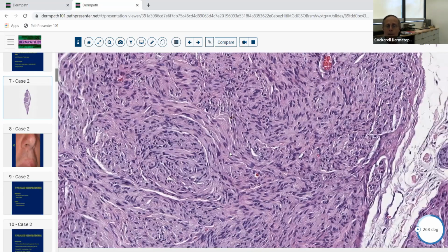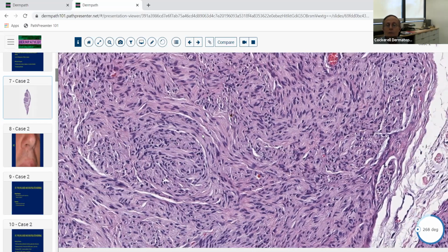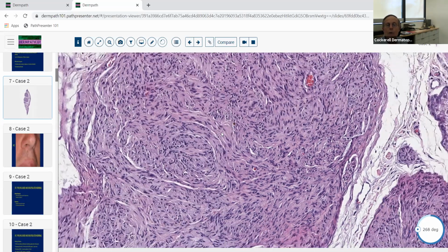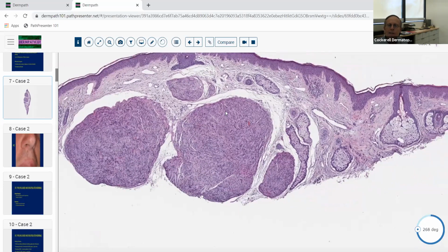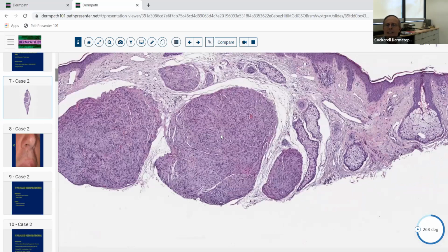And we're trying to distinguish those from one another. You look to see what the shape of the individual cells is like. These look like little delicate S-shaped cells here, and that favors neural also. So we're looking at the neural neoplasms. There are a whole number of these lesions. And when you see a little small papule like this on the face, it's got clefts around it, and these are said to be palisading.